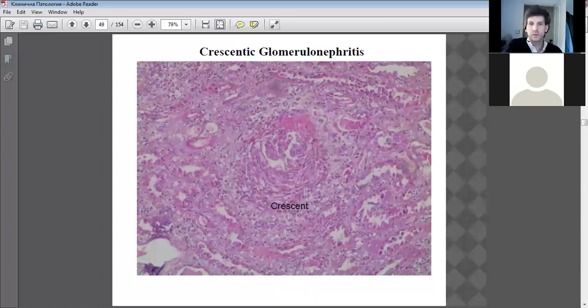The crescent structure. So this is a collapsed glomerulus, and total loss around it of tubules, spaces forming, all spaces everywhere as tissue starts to die away. So generally, a total loss of cell function, inability to filter, secrete, and reabsorb.